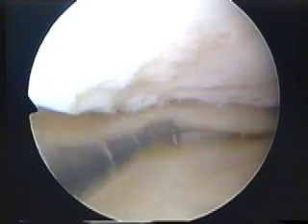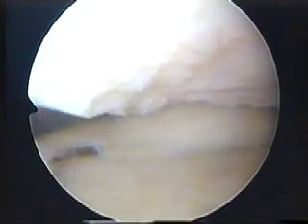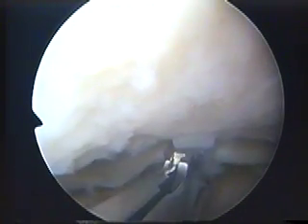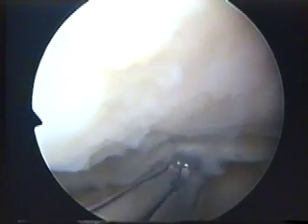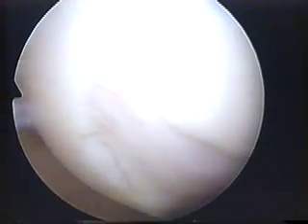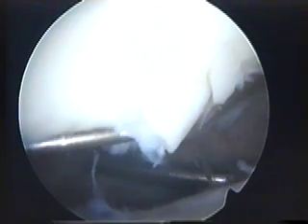That's the back part of the medial meniscus. It doesn't look quite normal — it's slumping forwards because it's torn internally. I'm just going along the edge of it with a pair of scissors, trimming away the leading edge. And there's the inner bearing of the knee after it's been sealed.